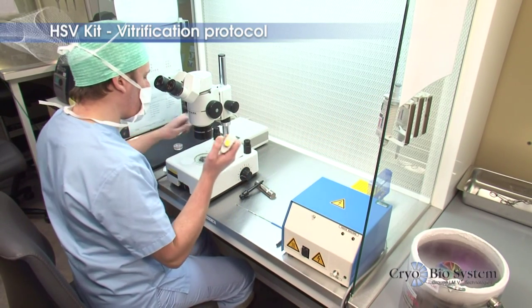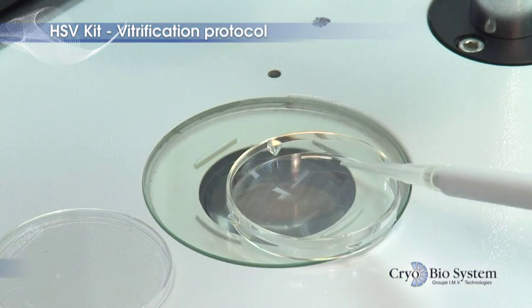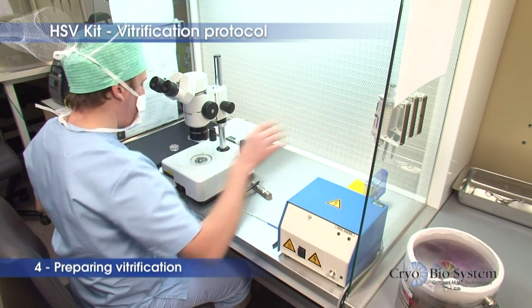Prepare the biological sample for vitrification according to the instructions provided by the media manufacturer. Be sure to comply with recommended exposure times for the different solutions.